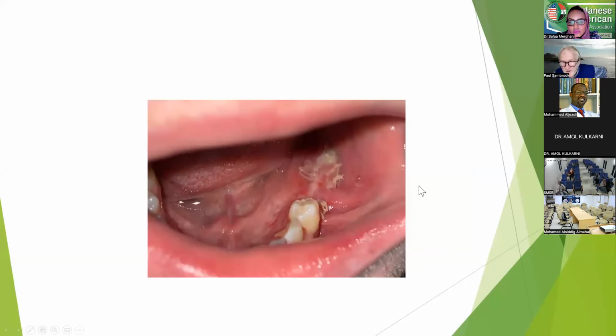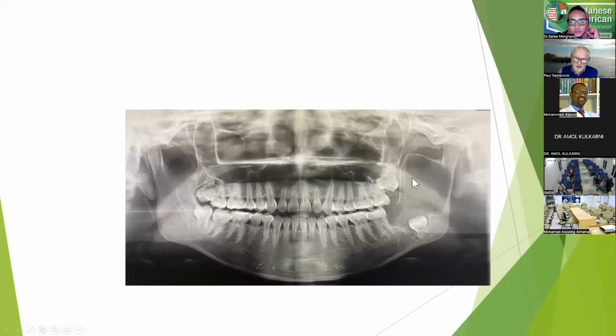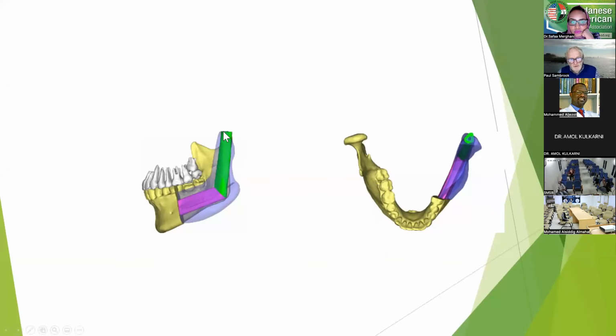And immediately post-operatively, as I've suggested, we can look at pre-planning implants into these areas and putting implants in so that the patients have a very good reconstructive option. Again, another large ameloblastoma in the mandible. Looking at a fibula this time, or a hip, and we're trying to determine what we might use for this particular reconstruction.